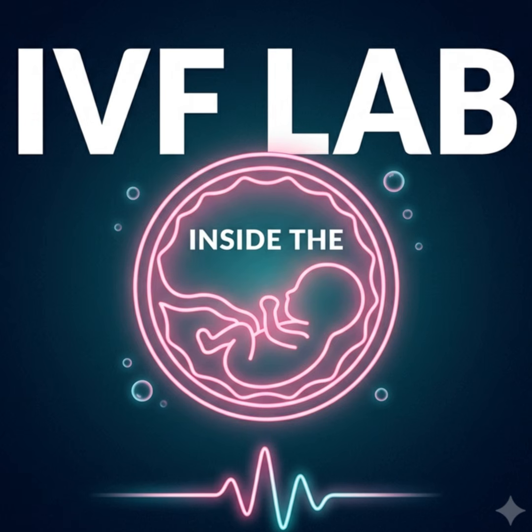Many studies, particularly retrospective studies, which look backward at data that has already been collected, show clear, undeniable advantages in specific clinic settings. They show that clinics utilizing time-lapse incubators and morphokinetic AI algorithms can achieve pregnancy faster, meaning it takes fewer embryo transfers to achieve a positive test. They also frequently show lower miscarriage rates. And the mechanism behind that lower miscarriage rate makes sense based on what we've learned, right? They are actively deselecting the embryos with hidden genetic chaos, like those that underwent direct cleavage. Exactly. The biological rationale is incredibly sound.